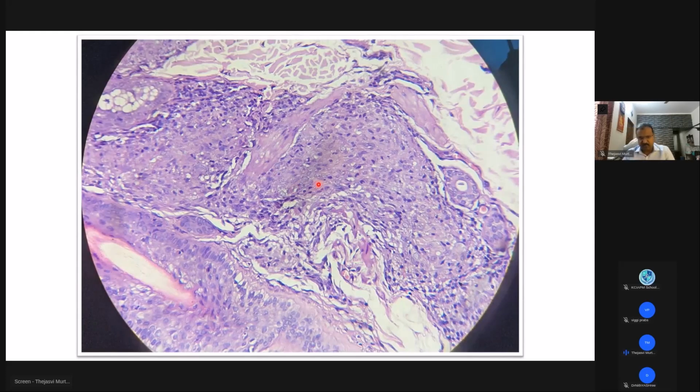So most commonly erector pili involvement is in borderline tuberculoid. These Hansen's disease cases will have granulomas. Since they are tuberculoid, they'll have destruction of the erector pili muscle or nerve bundles, with abnormally shaped, that is ovoid or oblong shaped granulomas, unlike the rounded ones in tuberculosis.